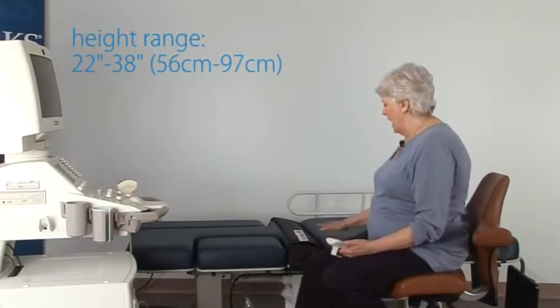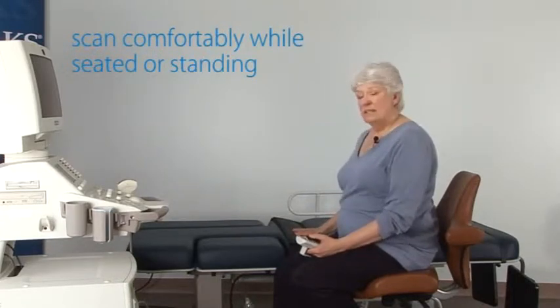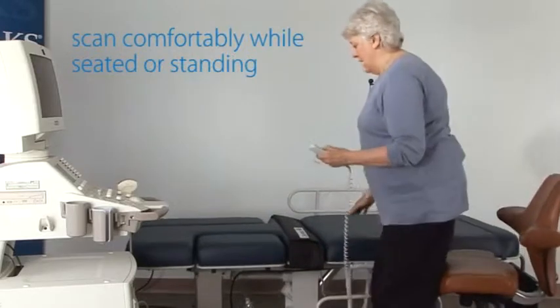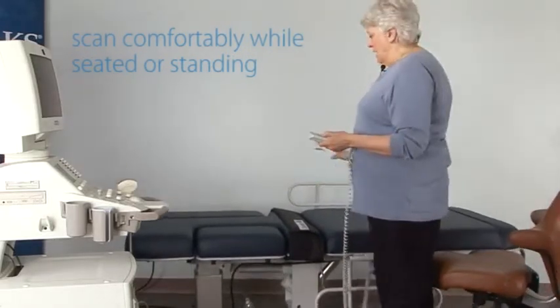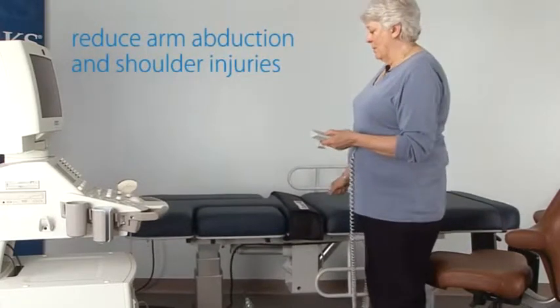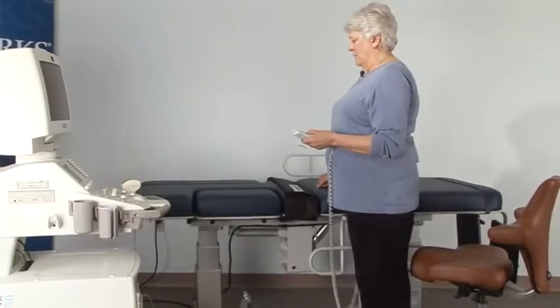The height range of this table is variable enough to allow for different scanning positions. I can scan comfortably seated with a very low height that also allows easy access for the patients, or if I choose to stand, the height range is enough to allow me to keep my arm close to my body and reduce arm abduction and possible shoulder injuries.